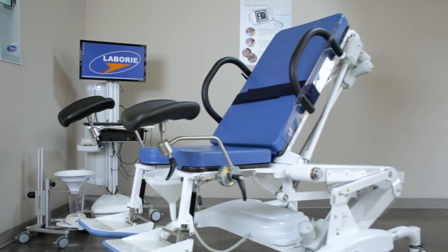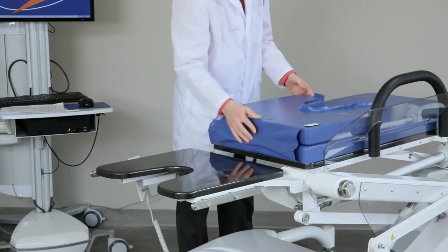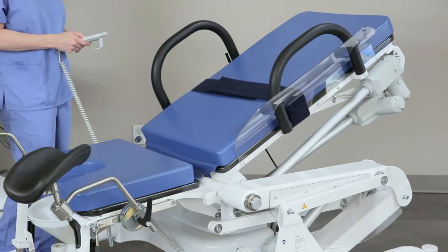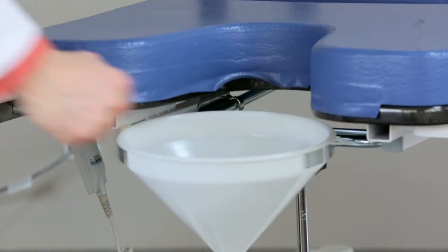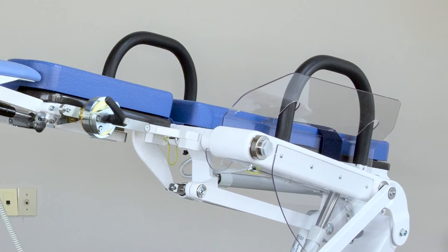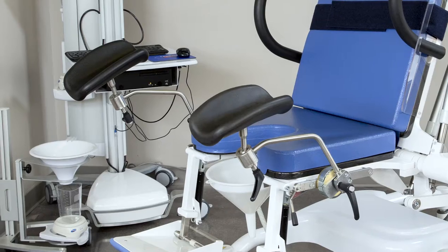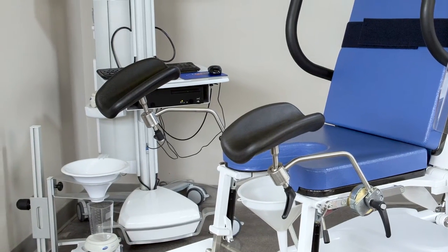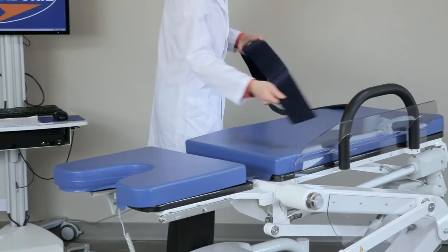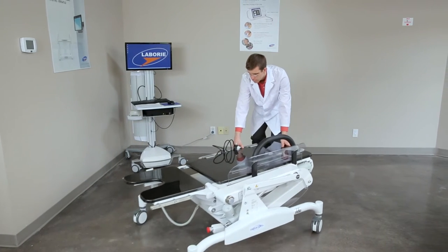The 6210 video fluoroscopy table includes the following standard accessories: a seat cushion, a hand control for the motors, a plastic funnel with holder, one fixed and one removable armrest, one removable side rail, two heavy-duty leg rests with holders, two fold-up foot rests, and optional restraint straps. To begin setup, remove the table and all accessories from the crate.